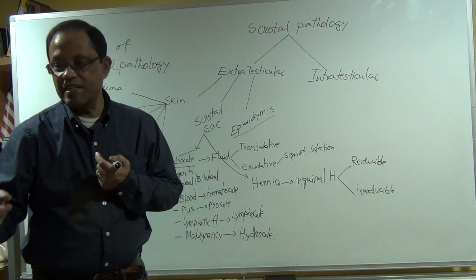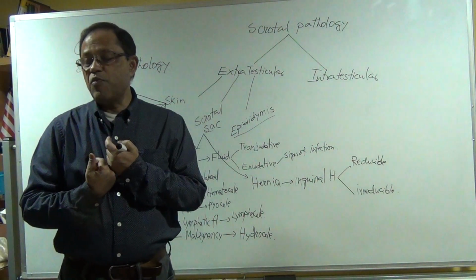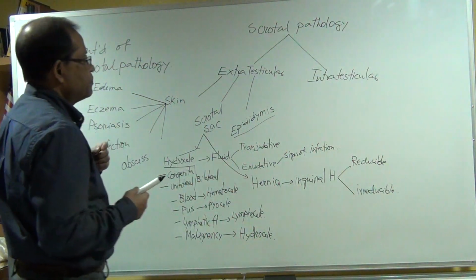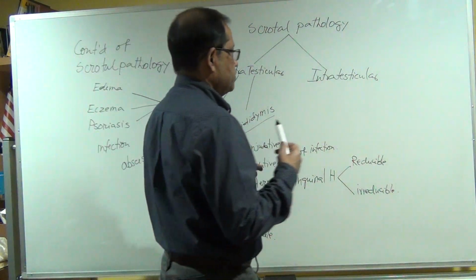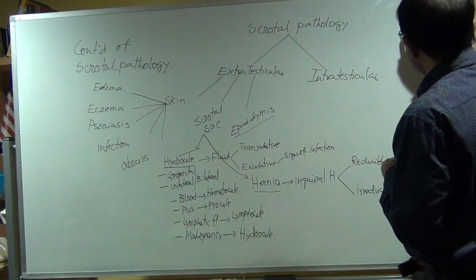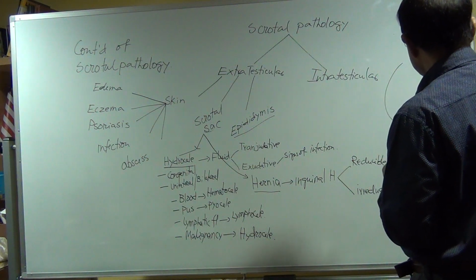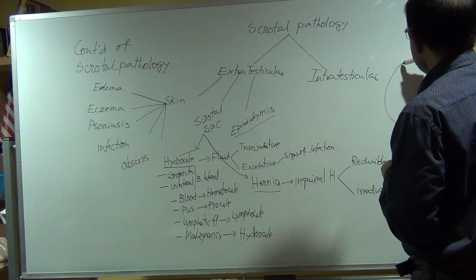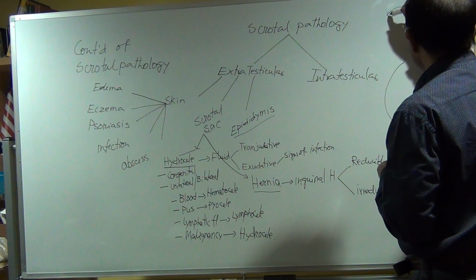That time you will see the patient came to you for ultrasonography. So now let me give you the idea in hernia. Let me give you the diagram. In hernia, so this is the scrotal sac and this is the inguinal canal.